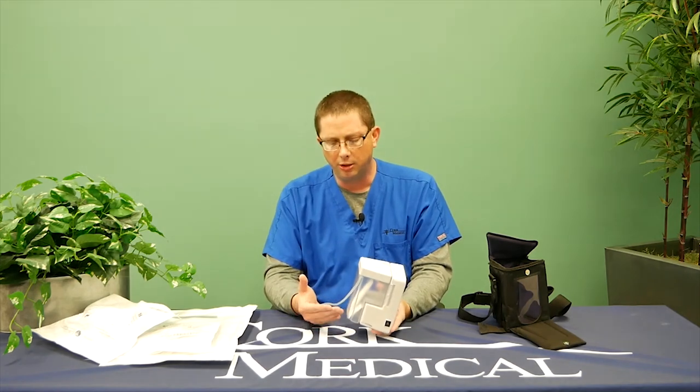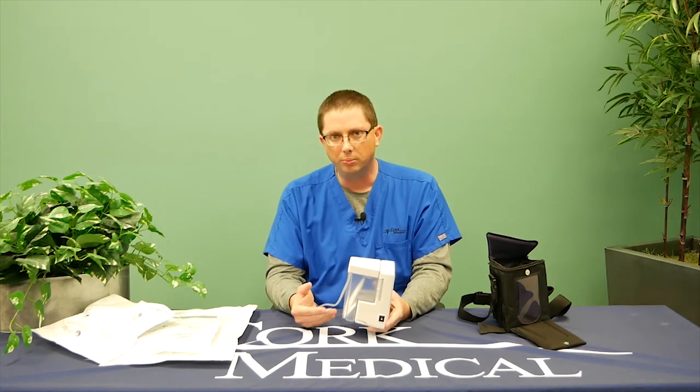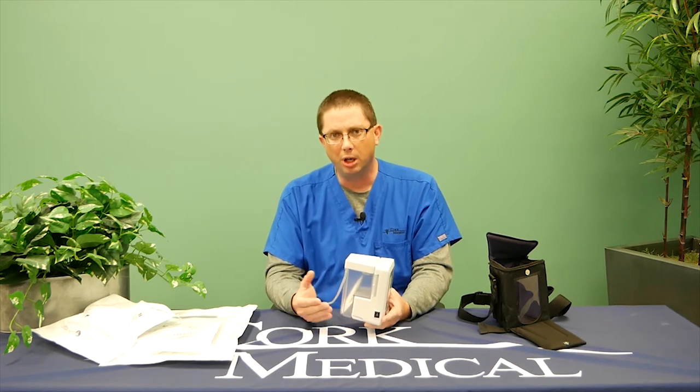If you notice any significant changes in your drainage — a smell or a change in the consistency of your drainage — you need to notify your medical provider of that change.